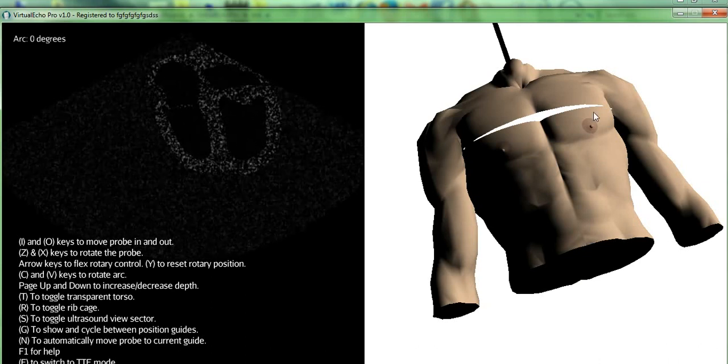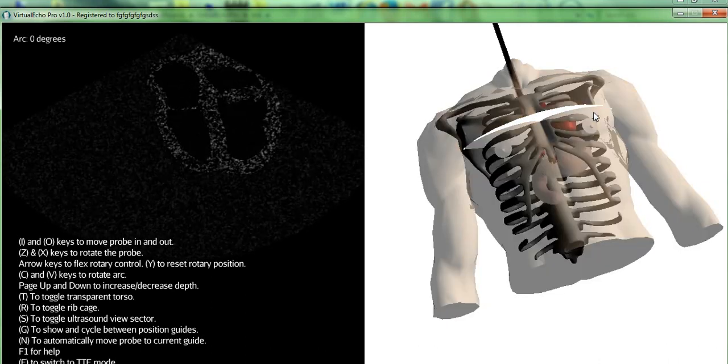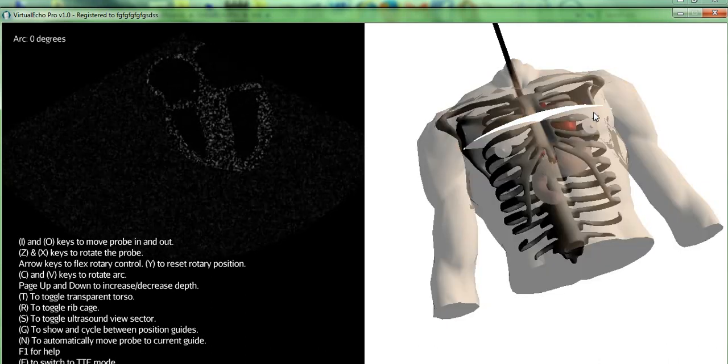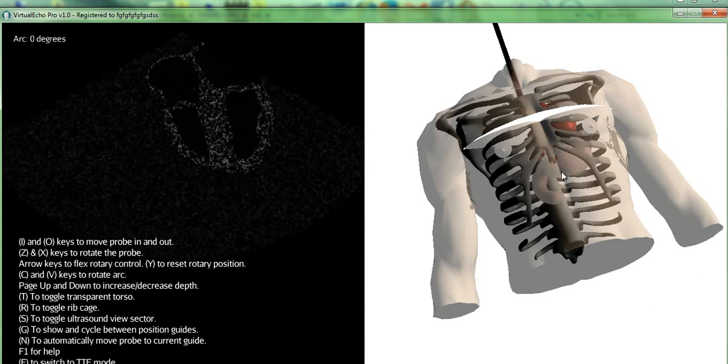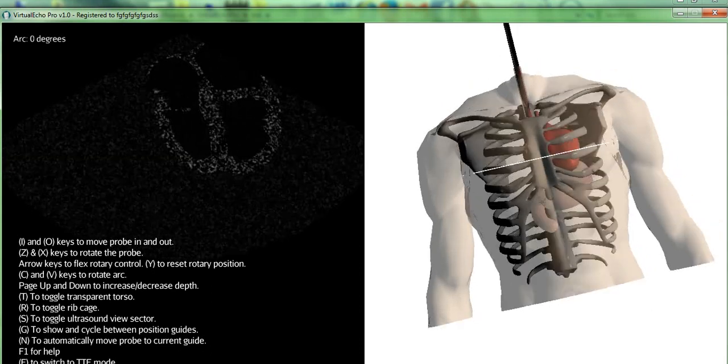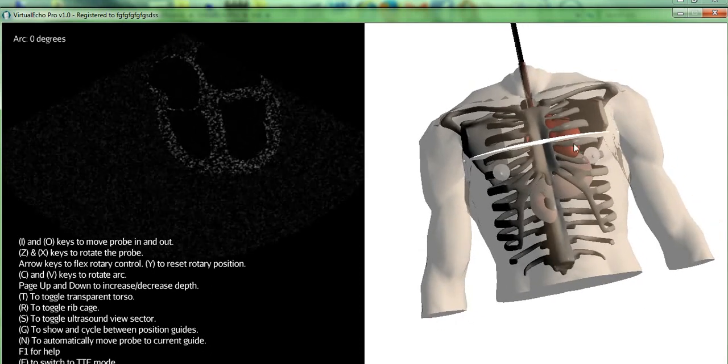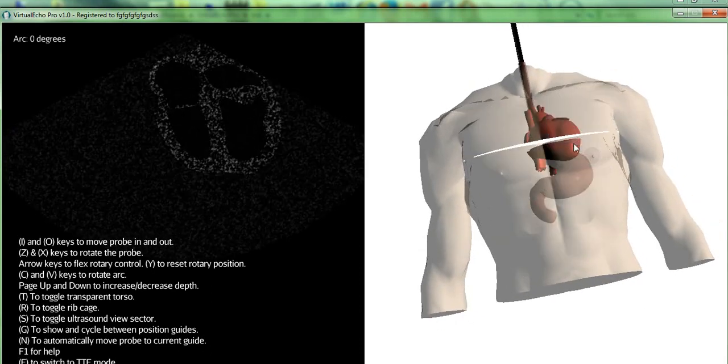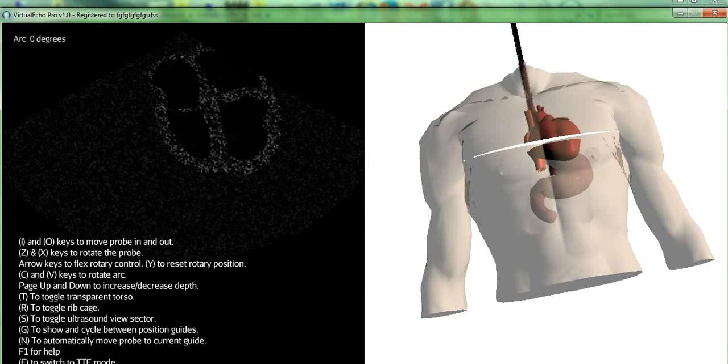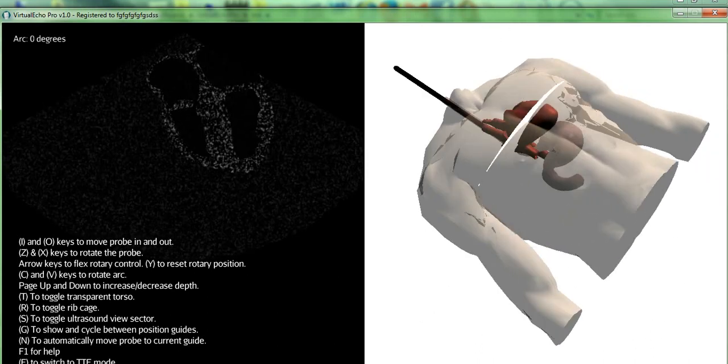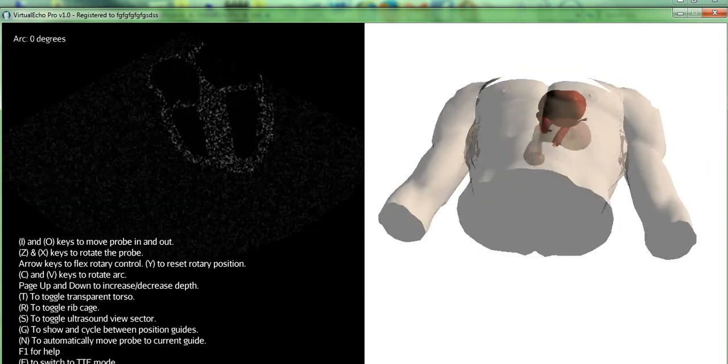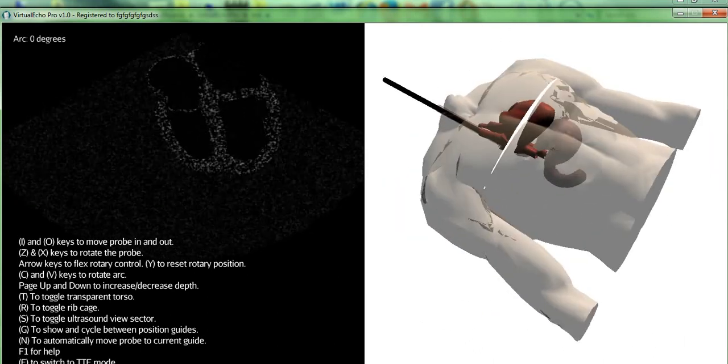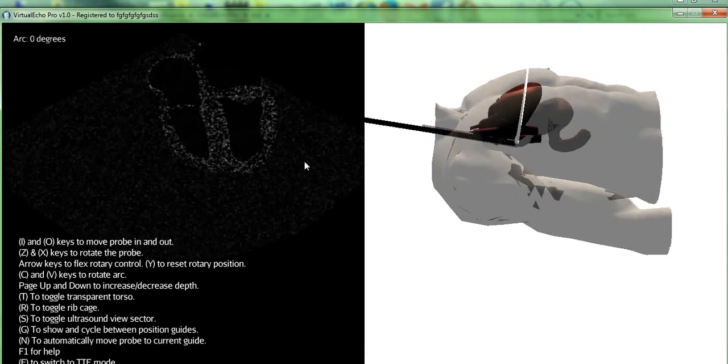We'll press the T key to make the torso transparent, same as in the Free Edition, and now you can see what's inside. I'll press R to remove the ribcage, and now I can see that the heart has the esophagus and stomach lying behind it, and the probe is all the way inside the esophagus.